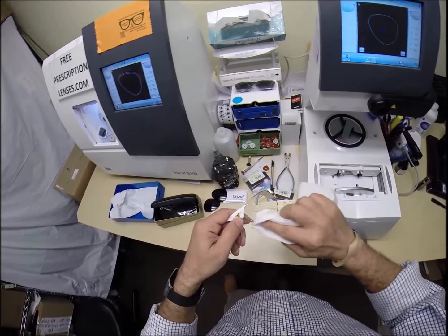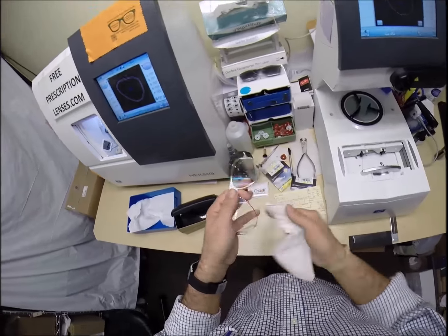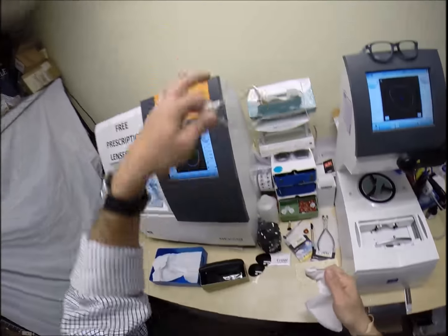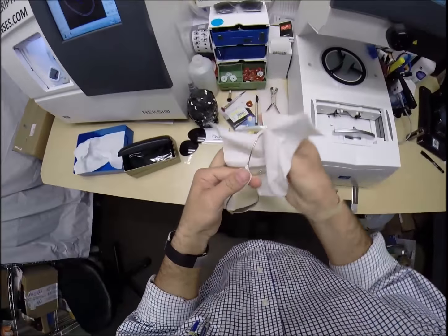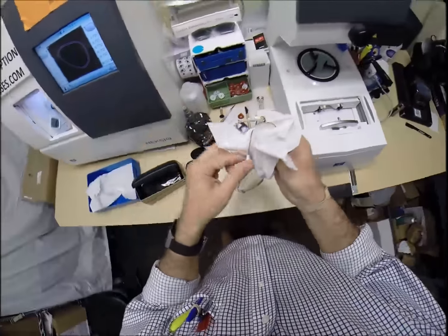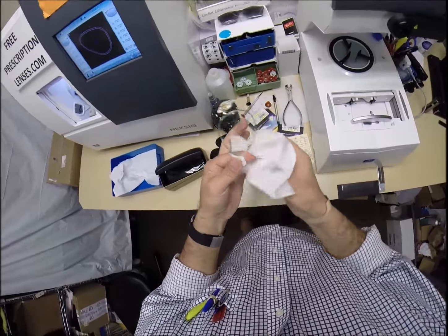But when you get these in the mail, there's a small chance that these could fit too loose or too tight. However, there's an 80% chance that one side is going to sit higher than the other. That is because 80% of people have one ear that is higher than the other. And because of that statistic, 99% of all optical shops will do free adjustments if you ask them.